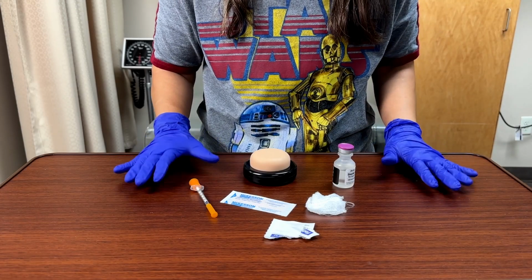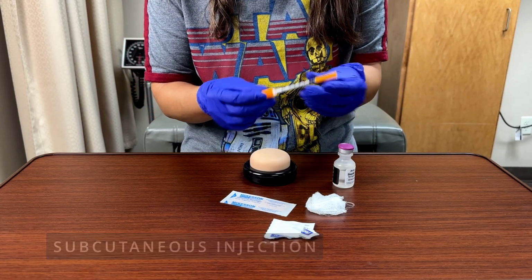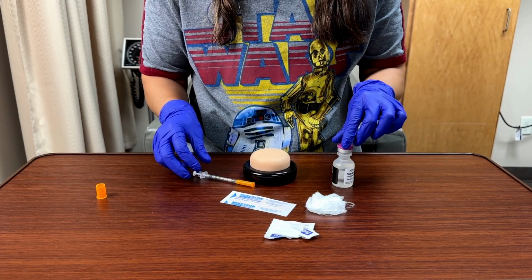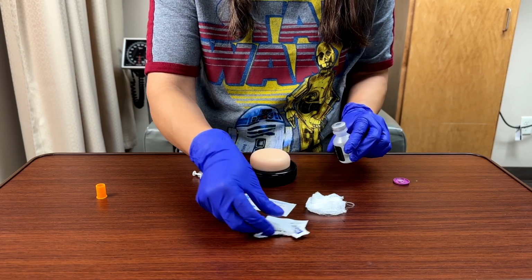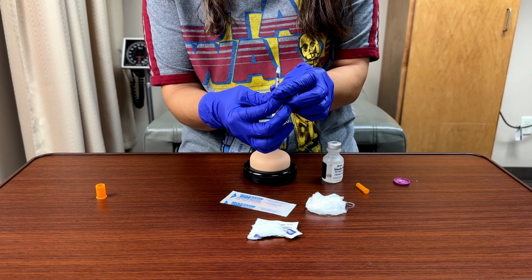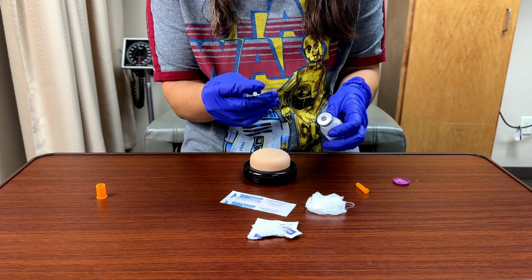All right, next up I'm going to show you how to do the subcutaneous injection. So for this one I have an insulin syringe. So I'm going to take this top off. It protects the plunger. And I'm going to take my medication out, my insulin. I'm going to wipe the top of it again. And then I'm going to open. Now these needles are really, really tiny and delicate, so you need to be very, very careful with them when you're withdrawing the medication. So I'm going to give 10 units of insulin.